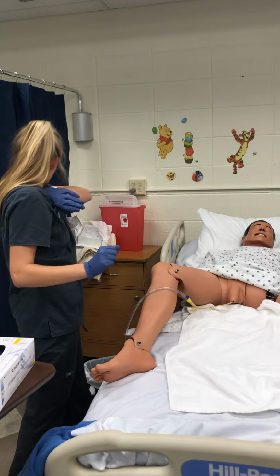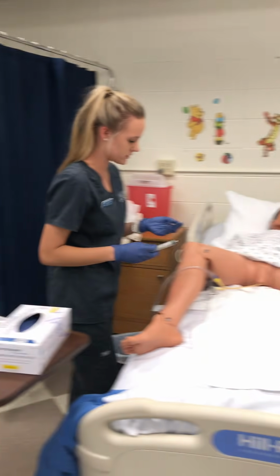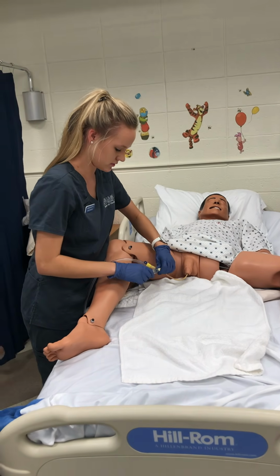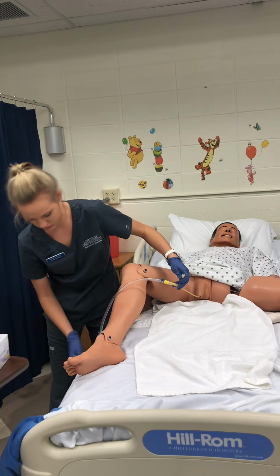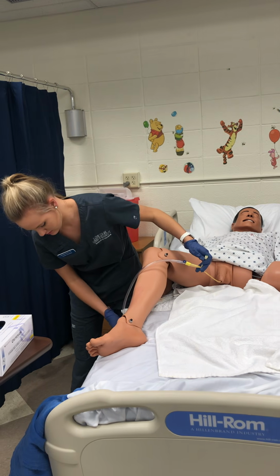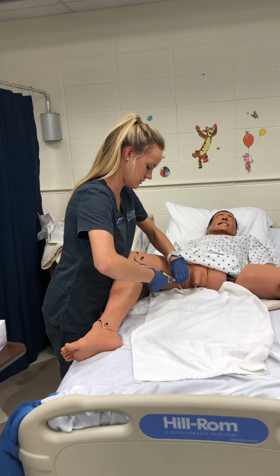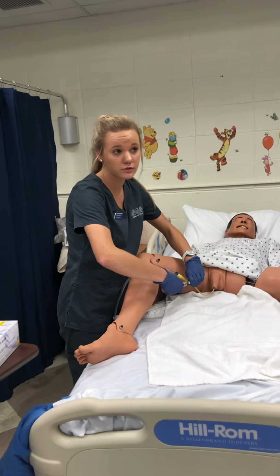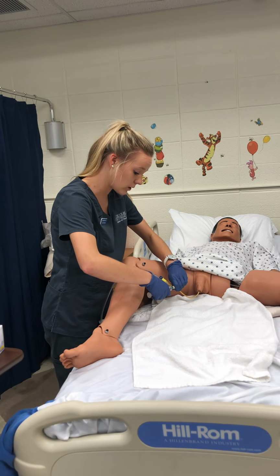Okay. Mr. Jones, I'm going to deflate the balloon. First, I want to detach it from the bed sheets. I'm gonna get that in a minute. Okay, so I'm gonna go ahead and deflate the balloon. So I want to check how much was inflated into the balloon. I had 10 milliliters, so I want to make sure 10 milliliters come back out.